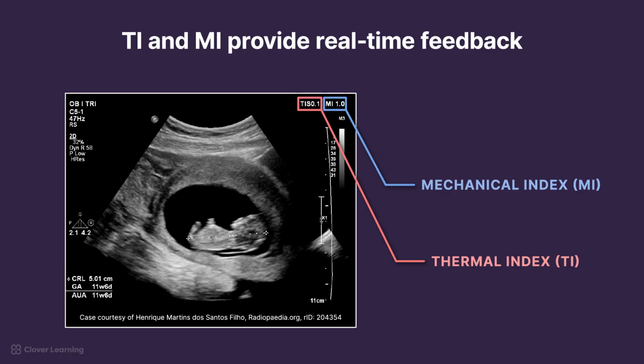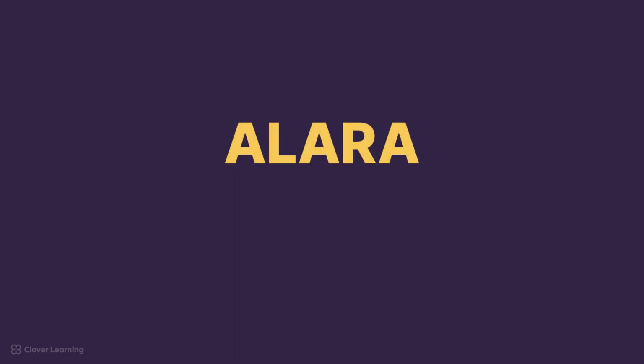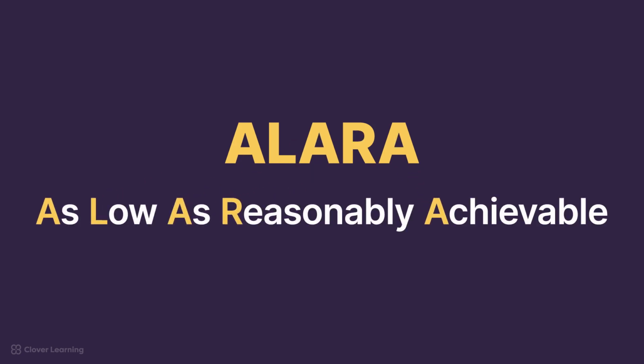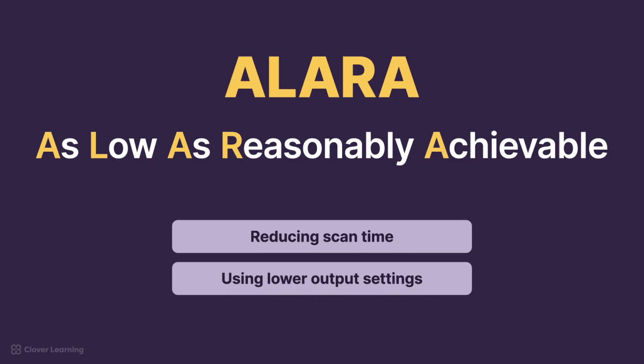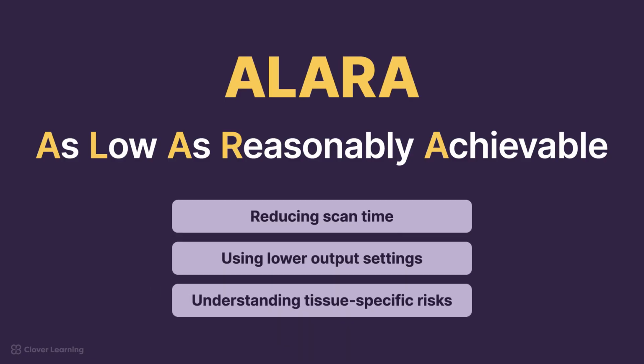Both the TI and MI provide real-time feedback, which is visible on the ultrasound monitor, to sonographers and physicians regarding potential bioeffects. Clinical best practices aim to maintain these indices at the lowest settings necessary to achieve diagnostic quality images. Strategies for minimizing bioeffect risks are informed by adhering to the ALARA, or as low as reasonably achievable, principle, to ensure ultrasound exposure is minimized while maintaining sufficient diagnostic information. These strategies include reducing scan time, particularly in fetal and pediatric imaging, using lower output power settings when feasible, and understanding tissue-specific risks, such as higher thermal absorption in bone and increased cavitation likelihood in gas-containing structures.